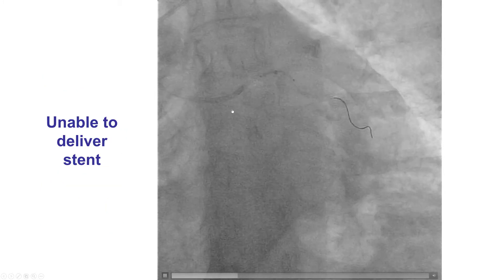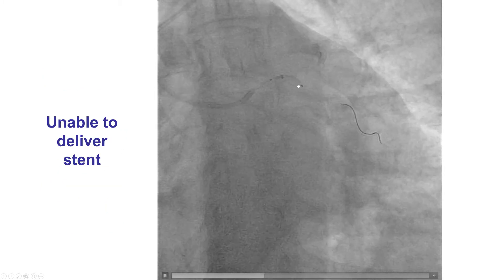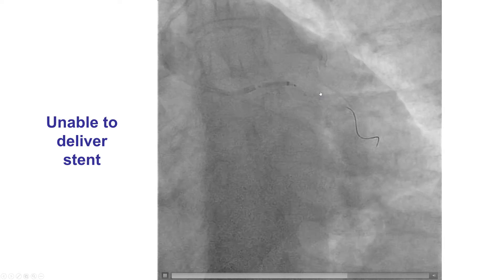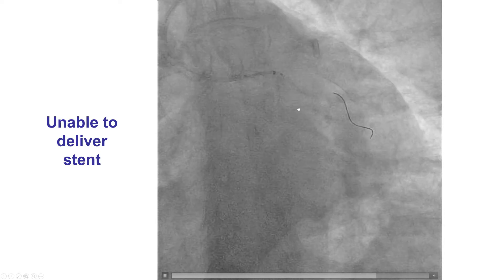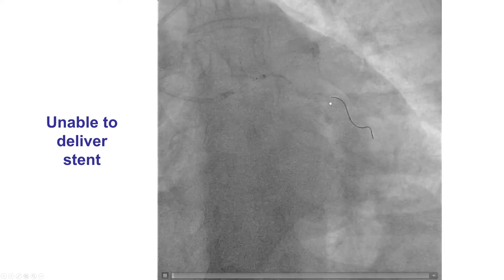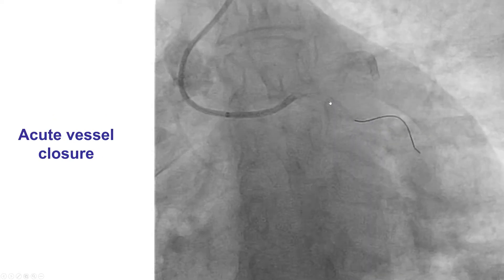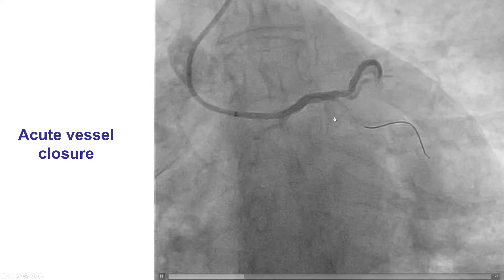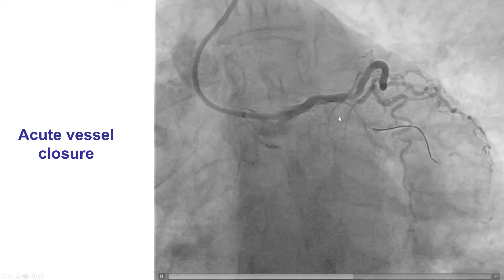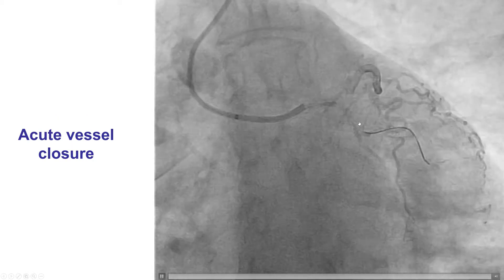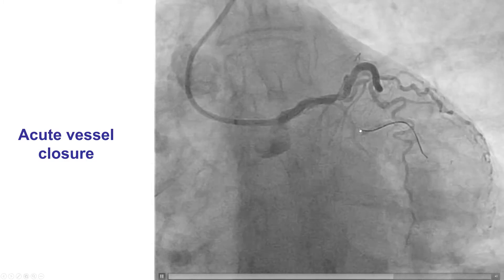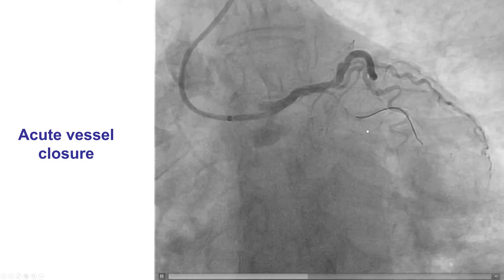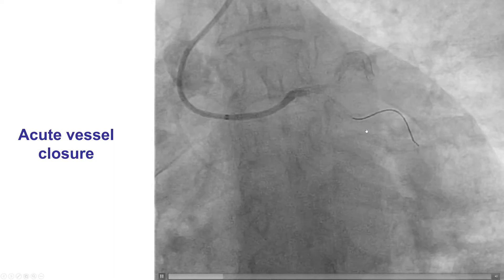Despite that, we were unable to deliver a stent, probably because of tortuosity and some calcification in the left main and circumflex. During those attempts, the patient started developing severe chest discomfort, at which time imaging demonstrated cessation of flow — essentially, we had acute vessel closure.